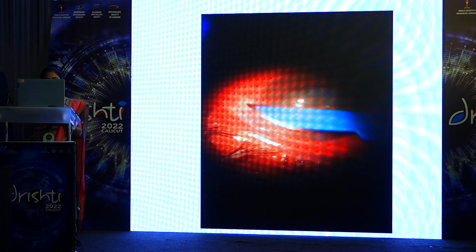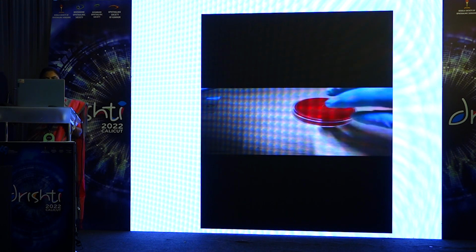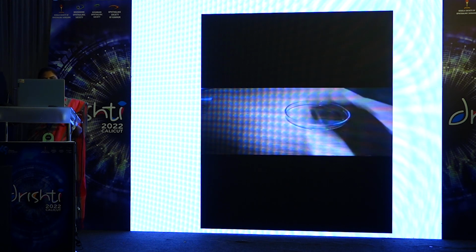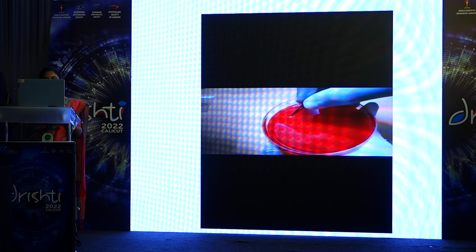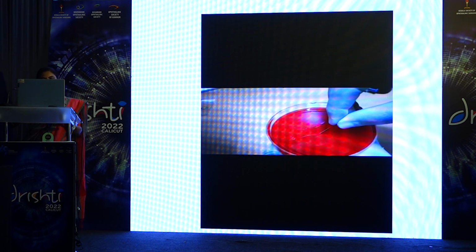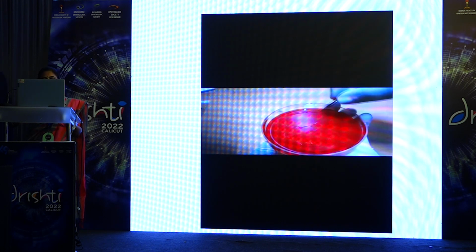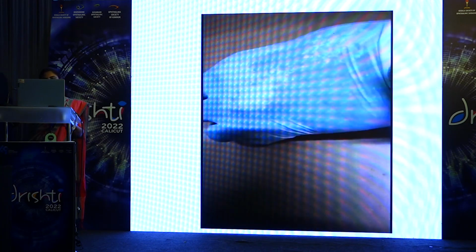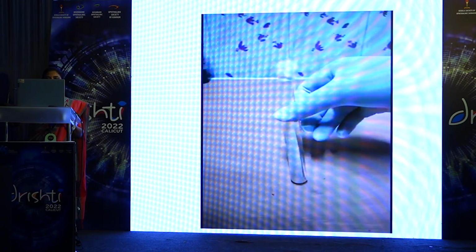In this, I am showing the scrapings being used for the culture. When you take the culture media, it's better to keep the lid on the table, because if you take it and keep it back, you might contaminate the lid. You take the culture media in your hand and take the scrapings. Once you place it back, the chance of contamination is minimal. And you can even tape the edges of the plate, label it, and send it back for examination.